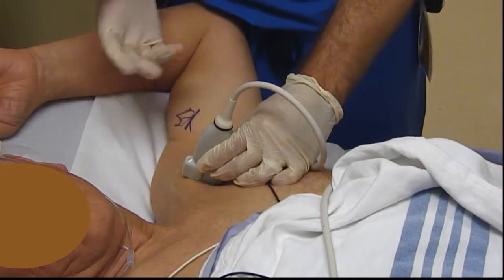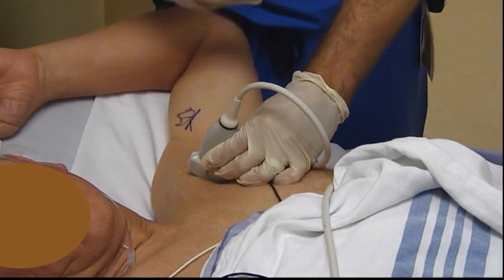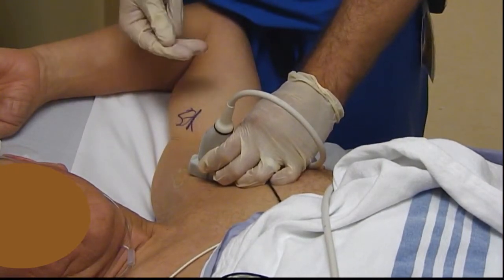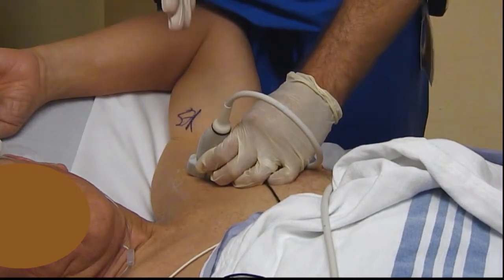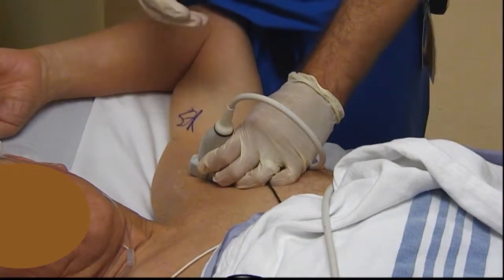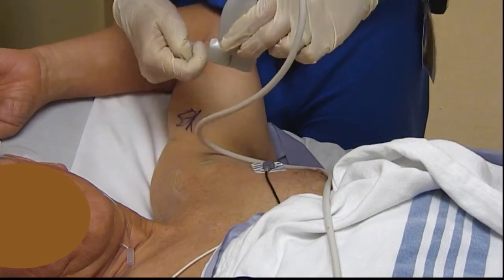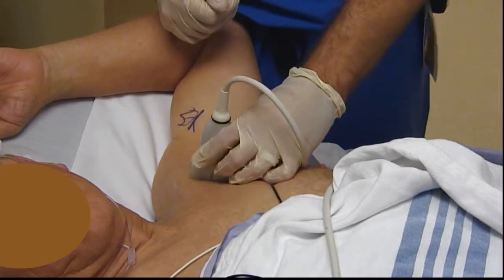The third important step is inserting the needle farther from the probe than you're used to seeing in ultrasound images on various websites, and the reason is simple. The farther away from the probe you insert, the flatter the angle of entry. The flatter the angle of entry, the better the ultrasound waves are going to reflect off the needle as opposed to refract off it. Ideally the needle is coming in at a 90-degree angle relative to the ultrasound beams — not always achievable, but you want to get as close to that as possible.